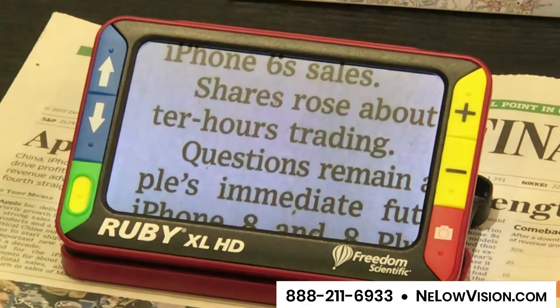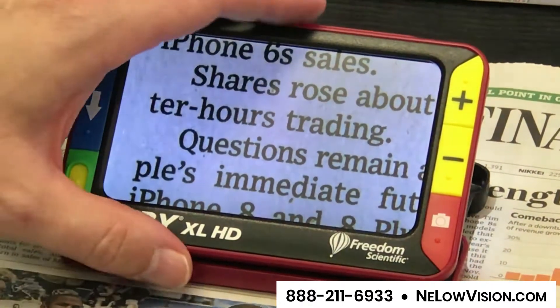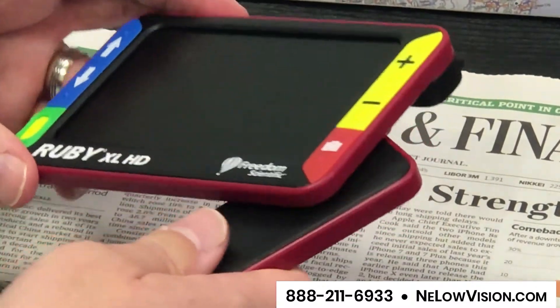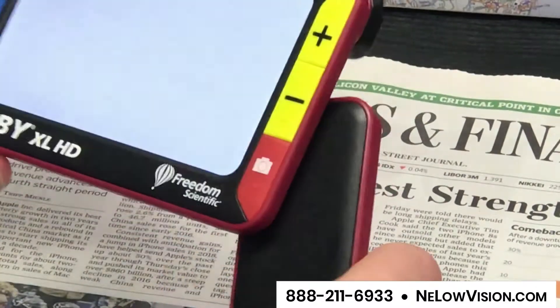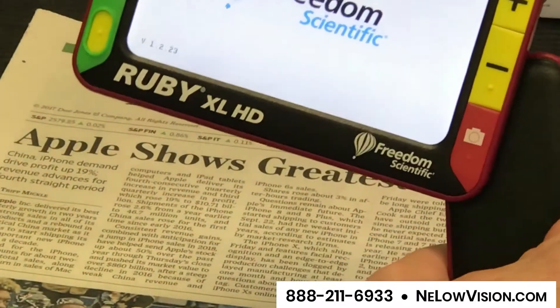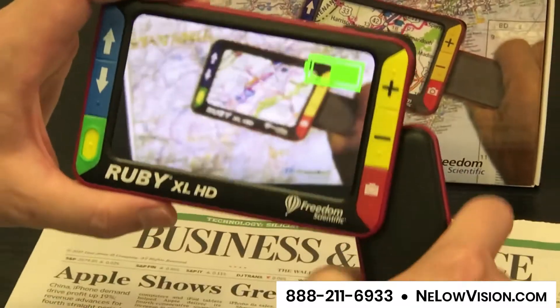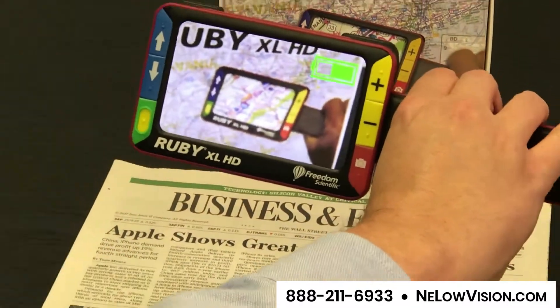Another nice feature is that if you have the stand in the closed position, you can open an integrated handle and use it in either an ergonomic position, or with the handle straight out.